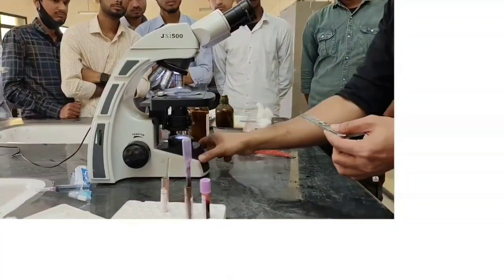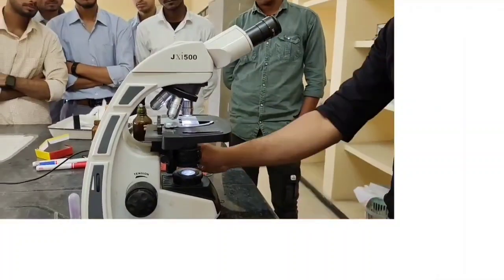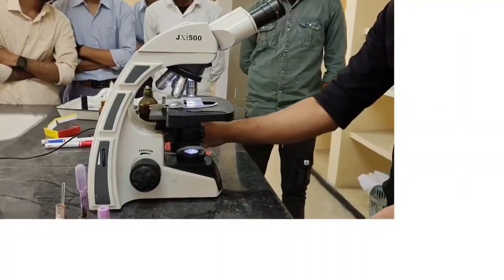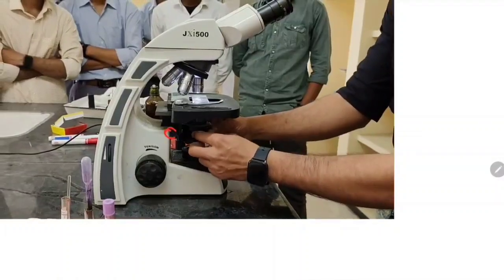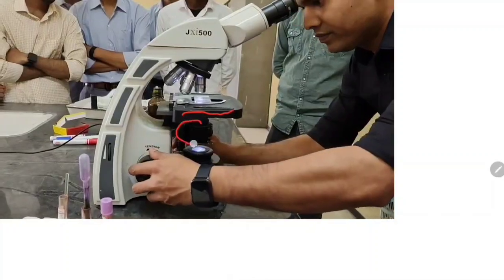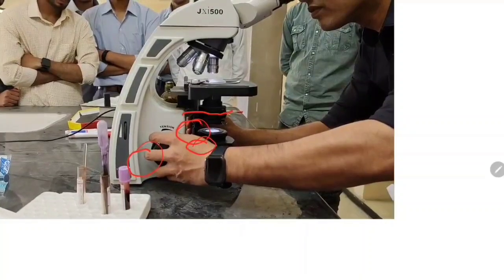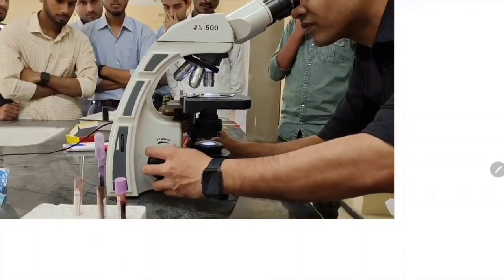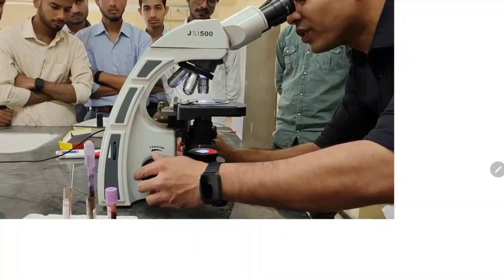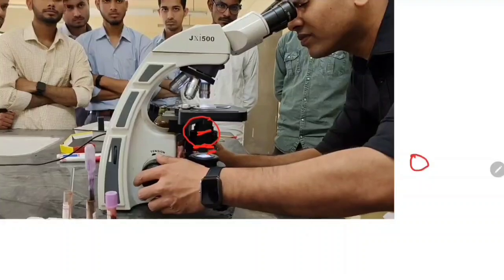We should be ready with all the instruments before performing the test. So this is the microscope. This area has the condenser. This is the stage and this is the substage, and this is the light source, and this is the fine and coarse adjustment. Inner side we have coarse adjustment and outer side we have fine adjustment. This is the condenser and the diaphragm is here, so there is one opening, and that opening we can close or open.